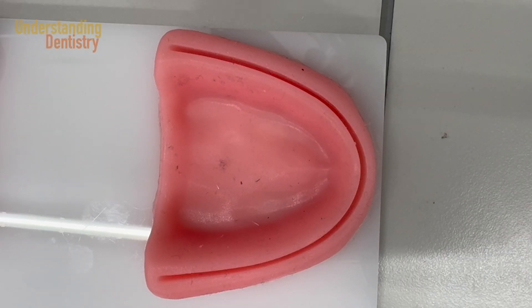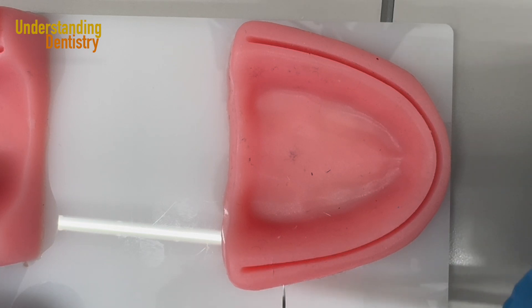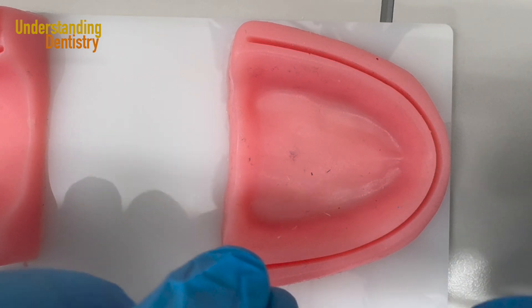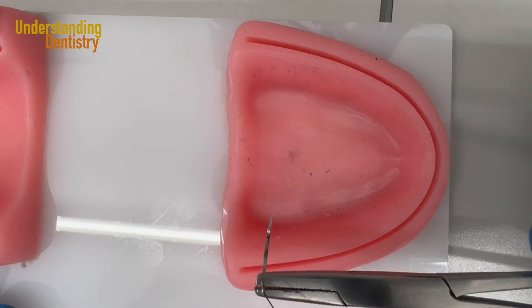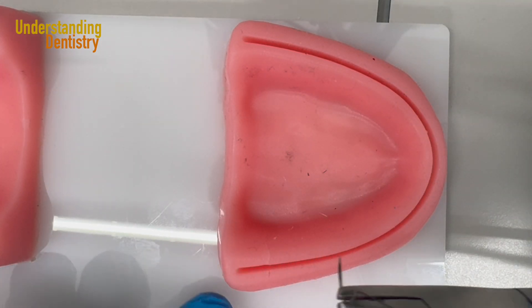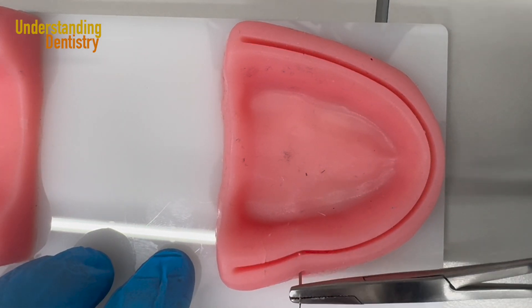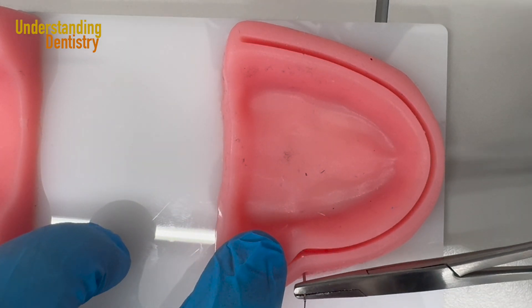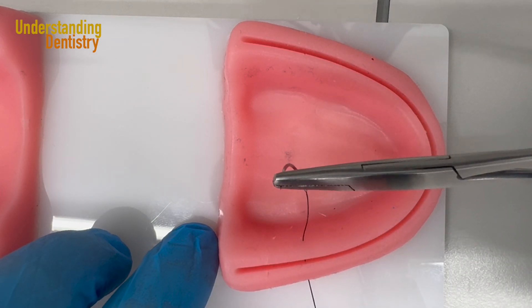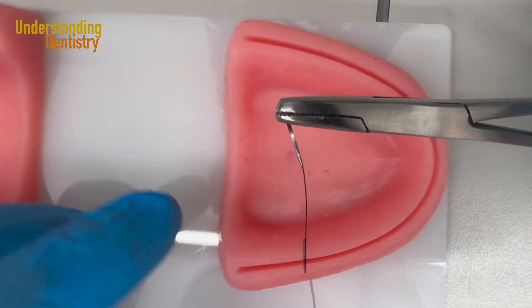Let's start with the interrupted sutures — the single sutures. I'm going to go from buccal to lingual. Please realize that I have a 90-degree angle between my needle holder and my needle. Don't forget that we need to do this rotation movement to capture from buccal to lingual. Since both borders are close to each other, I recapture with my needle holder.